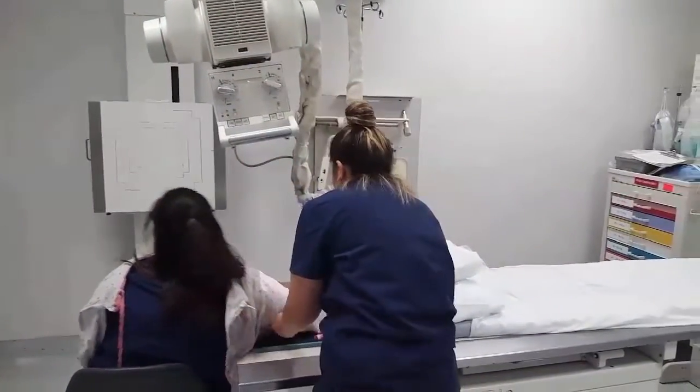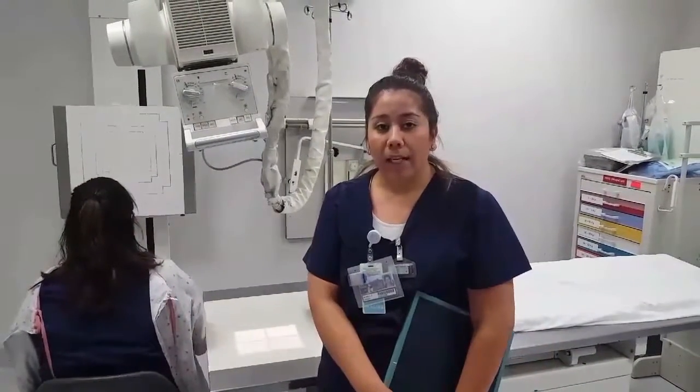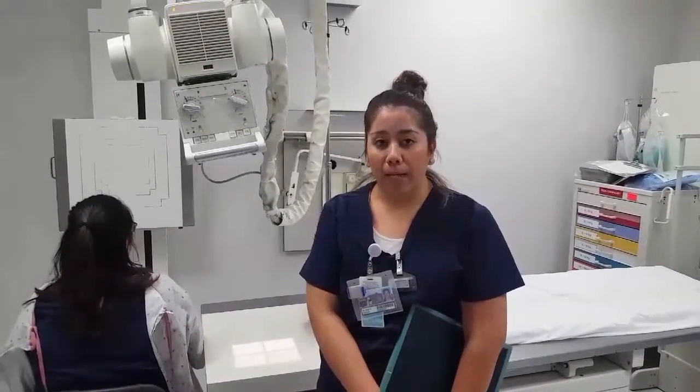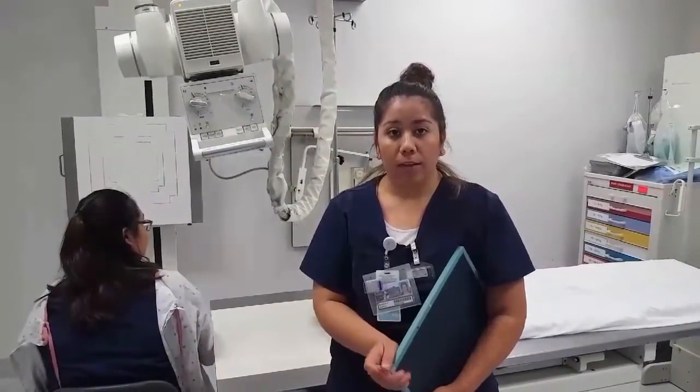You could relax. And my technique for this projection was done at 75 kVp and around 5 to 8 mAs. And this concludes our 4 projections of the shoulder. Thank you.